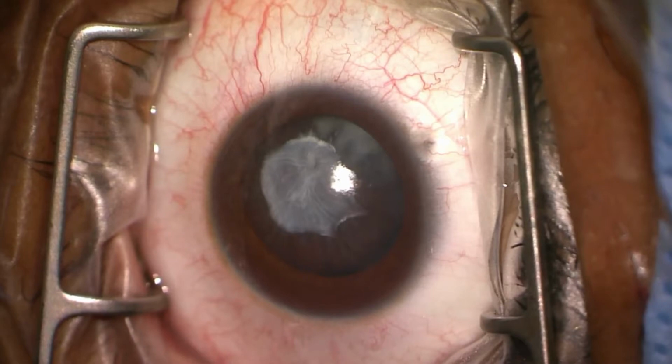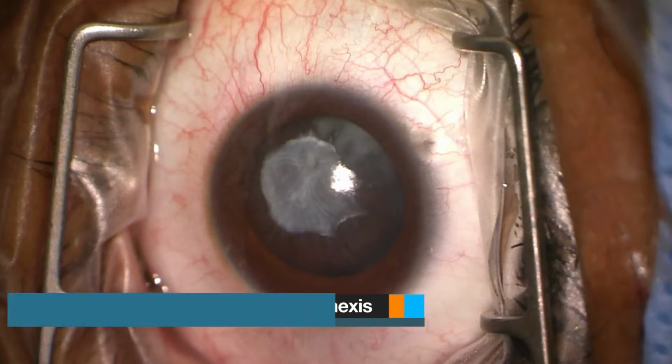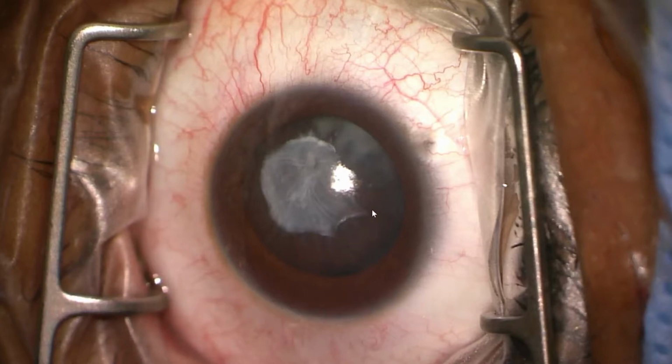So we have a capsular plaque that's pretty obvious right there in the center. Hopefully by now you're aware that this is not going to tear. This is not going to work at all like a normal capsulorhexis. So we're going to have to make a tear outside of that plaque. The thing that stands out immediately at the beginning of the case, though, is this plaque is decentered, and there's not a whole lot of area up there for it to tear. And so we need to begin thinking about our approach.